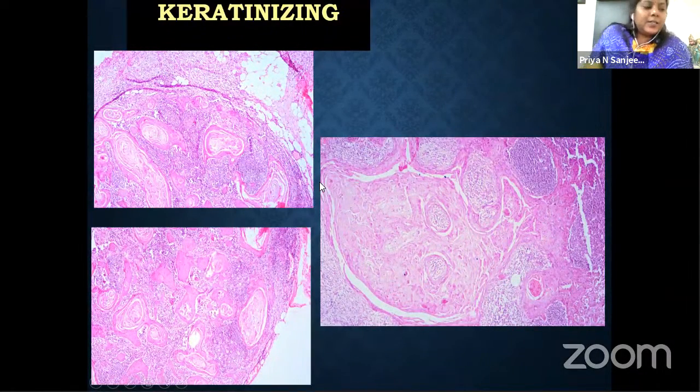Next is about the patterns of lymph nodes. As we see in the primary tumor, there can be keratinization within the lymph node. So these are the three examples of keratinizing squamous cell carcinoma, which has involved the lymph node. Adipose tissue you can see, but here you can see the tumor islands with a lot of keratin, and these are dysplastic in nature. And there's a huge keratinaceous area here. You can see some lymphoid follicles adjacent to it.